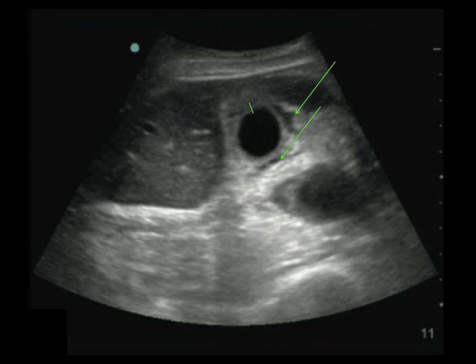So you might report to your senior, I see a thickened gallbladder wall with pericholecystic fluid. This is a case of acalculous cholecystitis, meaning the cholecystitis occurs absent any gallstones. This is an entity often observed in critically ill ICU level patients who may or may not be on TPN. It is thought that the lack of enteral nutrition and hypoperfusion creates this hypotonic, dilated gallbladder. Distension of the gallbladder increases the gallbladder wall tension, further impairing the perfusion of the gallbladder, which can lead to necrosis and perforation of the gallbladder. Superinfection with enteric bacteria may occur, but a lot of these cases occur without bacterial infection.